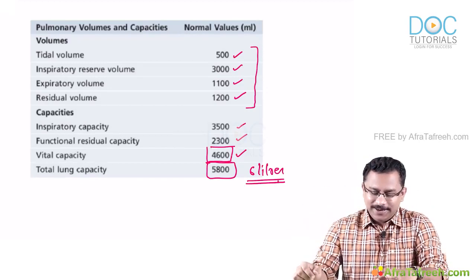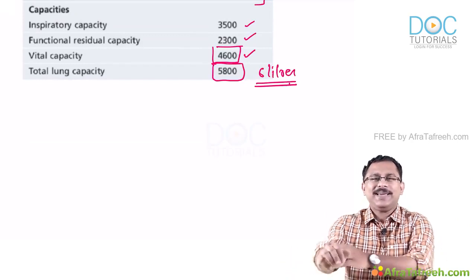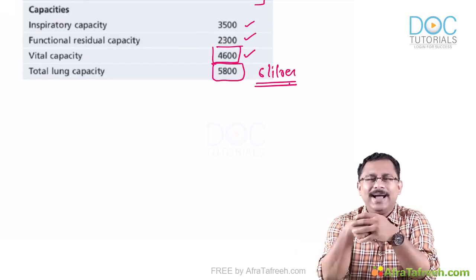Now let's move to the basic spirometry. Spirometry is a simple technique, and most hospitals have a spirometer lab.